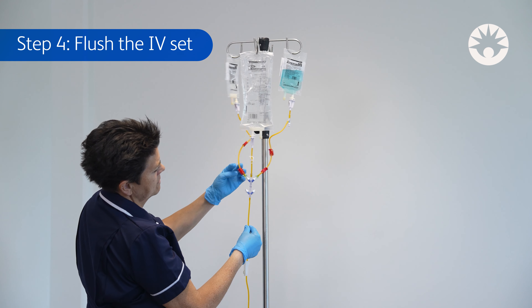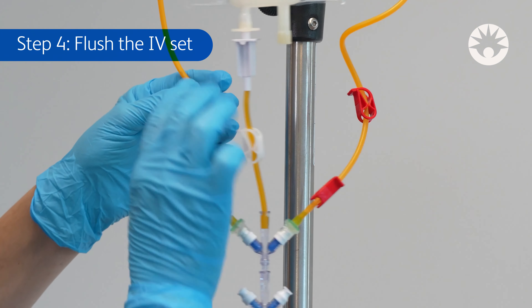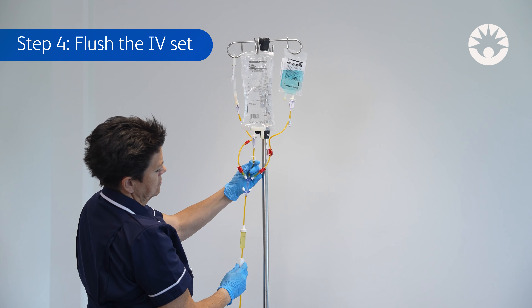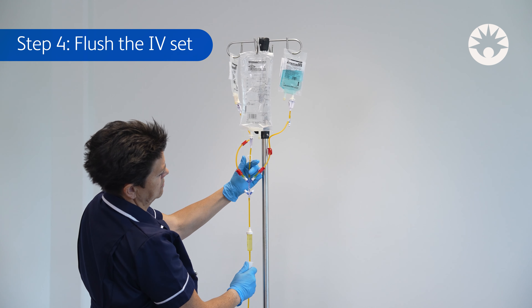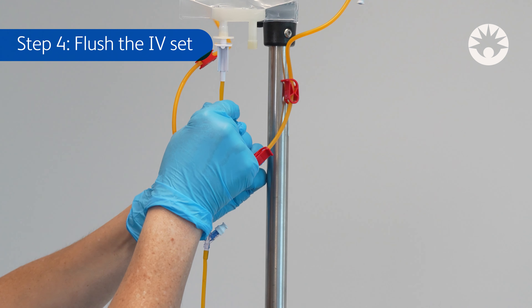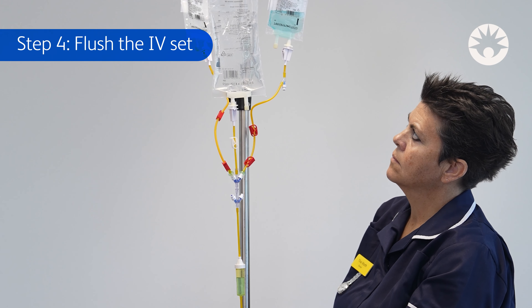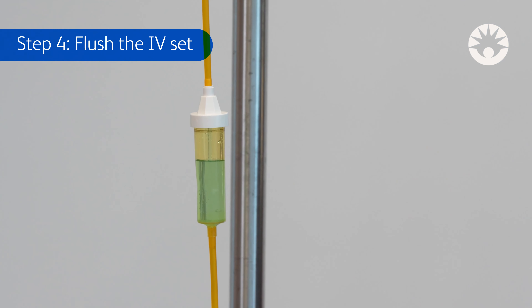Step 4: Flush the IV set. Once the secondary infusion is completed, close the clamps of the set. Before starting the next infusion, the primary line needs to be flushed with saline. To flush, open the clamp of the primary set. Repeat steps 3 and 4 for each drug to be infused.